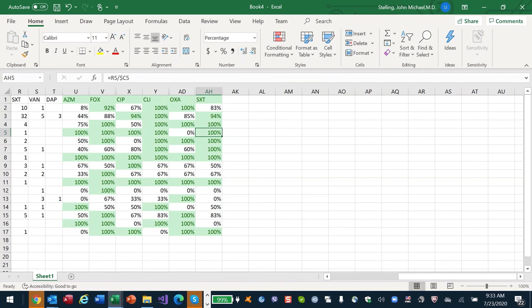We want to provide facilities feedback on probable errors, but we also want to provide the facility feedback on which antibiotics they should and shouldn't be testing. If disc availability is an issue, this is evidence for that. And then you can use that to try to come up with a national strategy for disc mass purchases, planning ahead of time, et cetera.